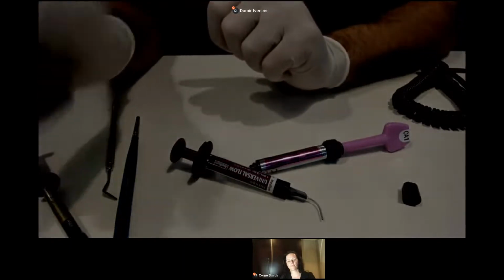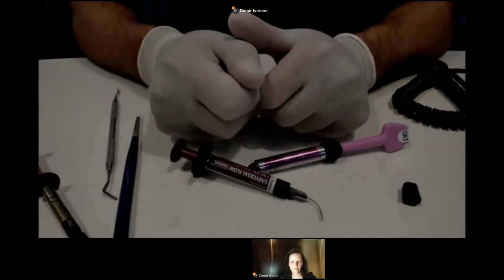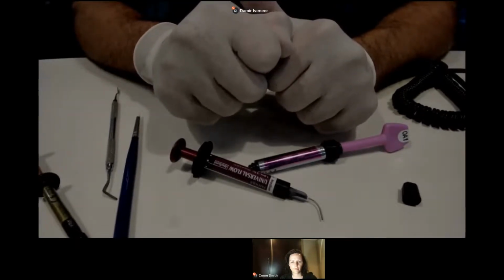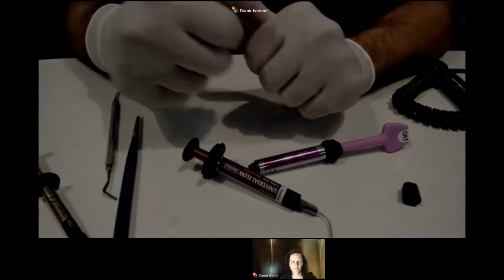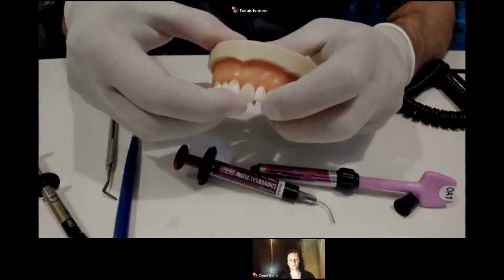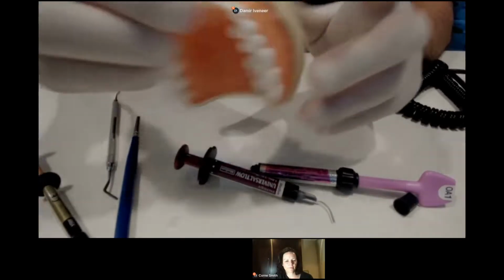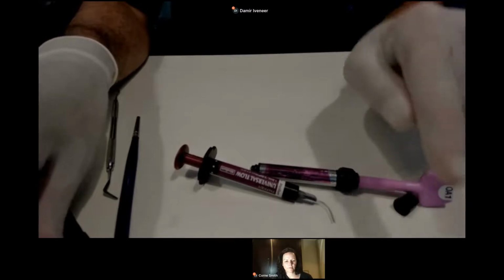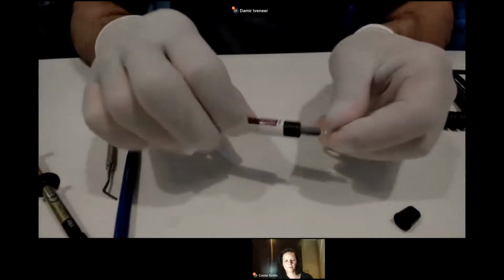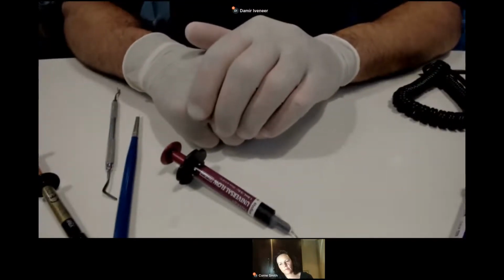But the advantage when you do this technique, like the so-called plastic spoons that you push, is that it won't change the shape of the veneer. And it doesn't matter if you push hard or not, because the final result is not from the pushing. The final result is from the template itself. And excess material won't go out from the side, which means that if you do it and if other dentists do it, you will have the same results. So this is another technique. You can use a paste composite material, you can use a flowable composite material, and you can use a warm paste composite material. Perfect.